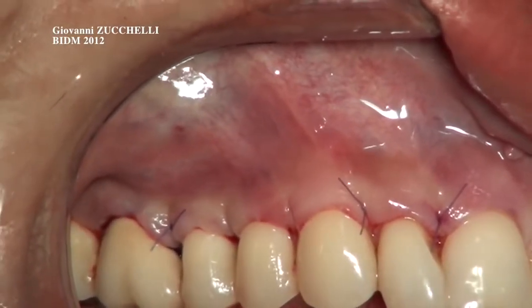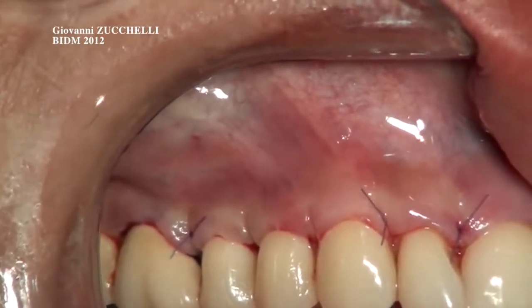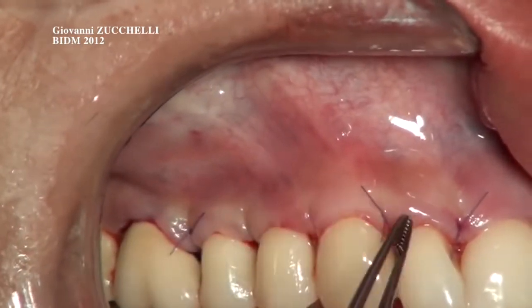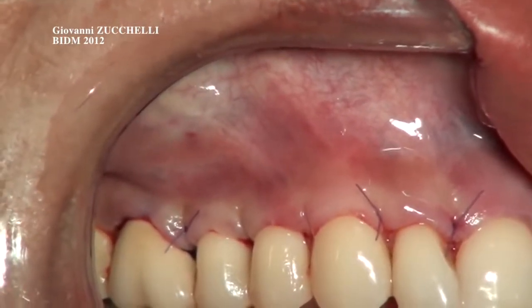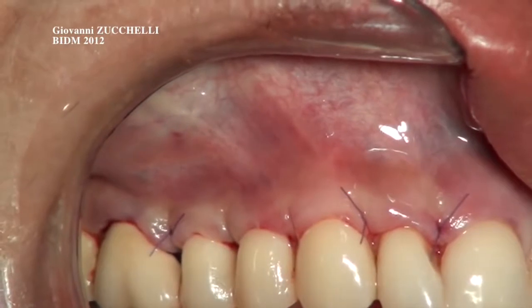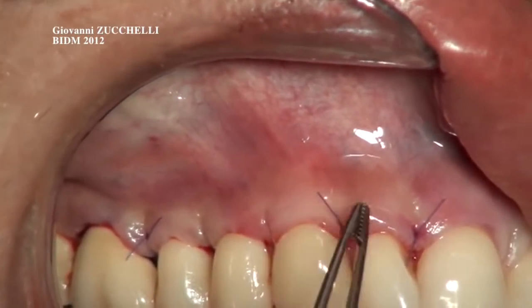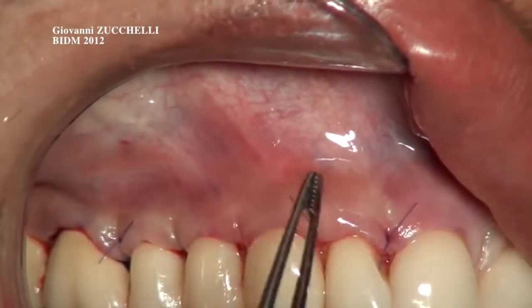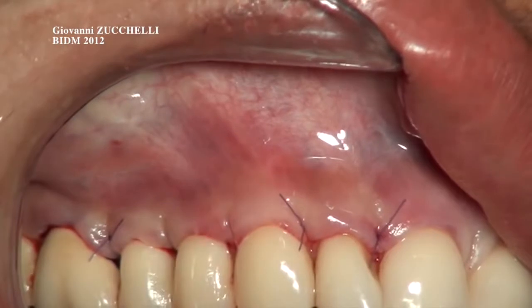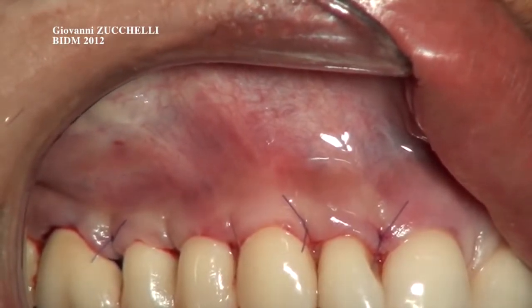And you see that there is some ischemia between the keratinized tissue covering the single crown and the crown itself. What does this mean? It means that between the lining mucosa and the concavity of the root, which was created during root planing, there is space for the blood clot to form.